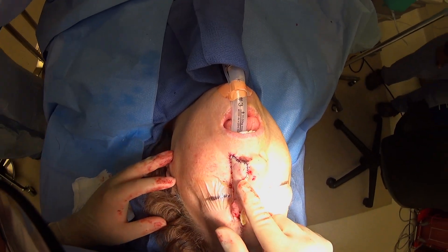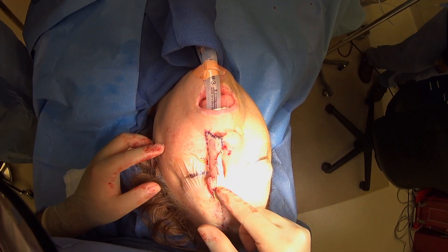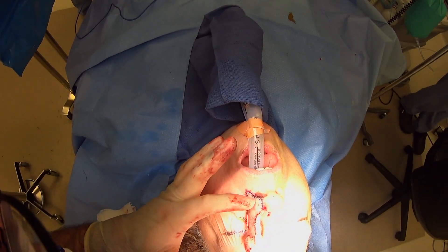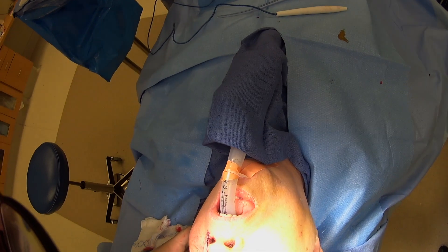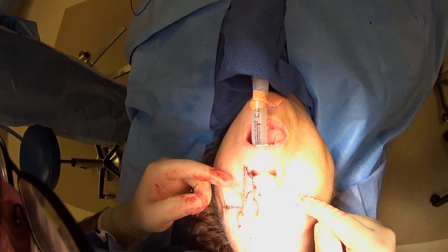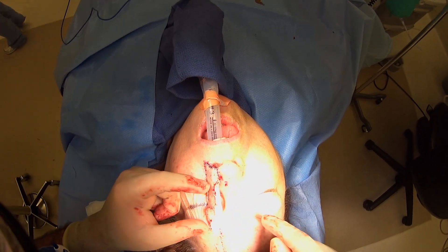Now you can see we've finished insetting our flap, all cleaned up. We just have a little gauze on the raw side so she doesn't bleed. You can see how nicely we've inset her alar rim — that's going to be a nice thickness for her when we're all set. Then we'll come back in a couple of weeks to divide this and inset everything.